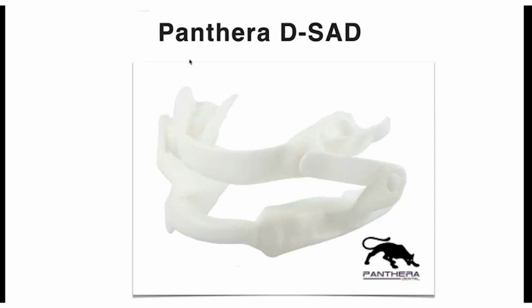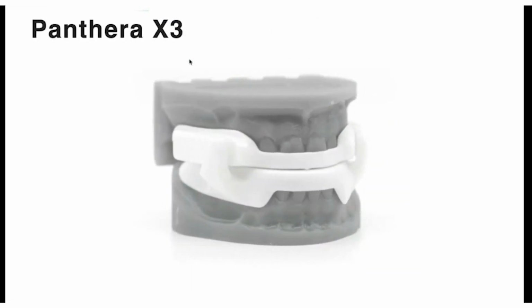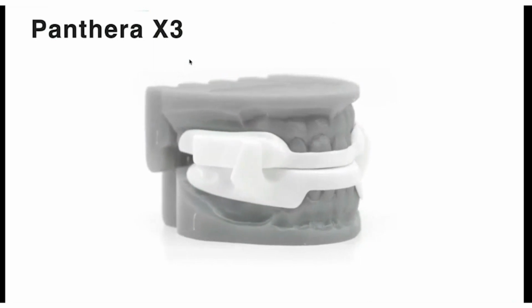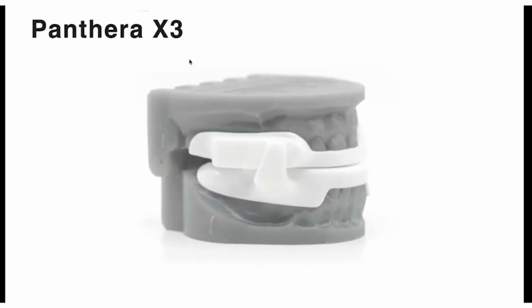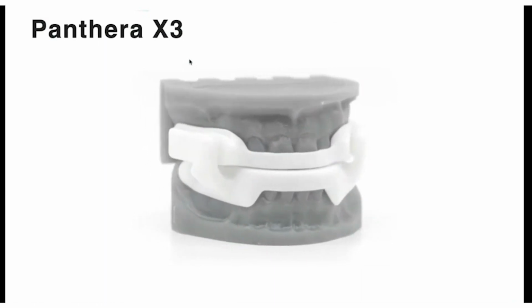So the DSAD is kind of the original nylon 3D printed appliance. You can see it's held forward by those straps, and you change those out to advance the appliance, and you can do it in millimeter increments. And this is now PDAC or Medicare approved, which might not mean much to you right now. But recently they came out with the X3, which is more of a dorsal fin type. And my sleep champion, my assistant dedicated to sleep, found this to be very comfortable.